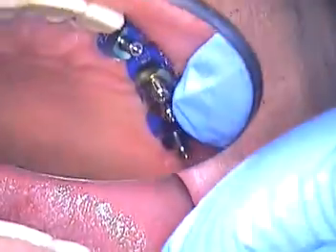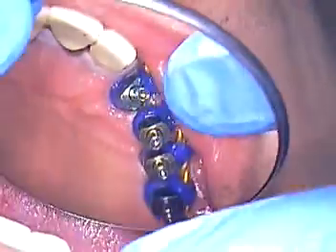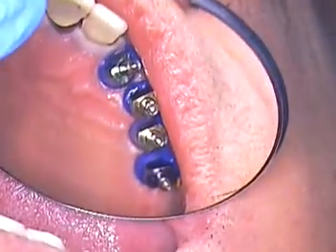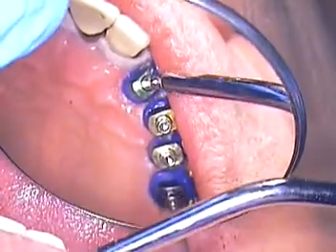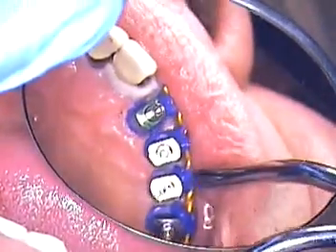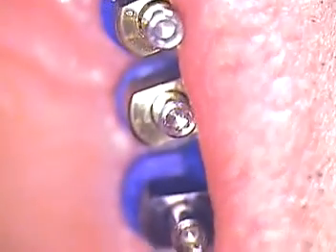Hello, this is Dr. Jerry Cuomo. I'm recording this video of my patient that is going to receive seven implants. They will be all fixed, posterior, one anterior placement. Right now what we've done is we've added the connecting bar along with customizing each of the abutments.